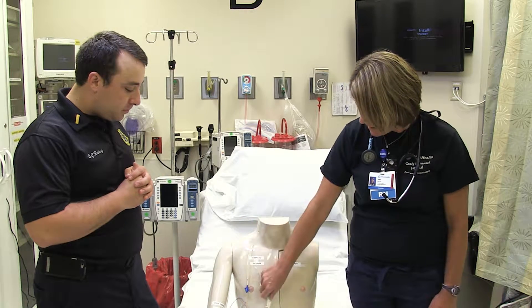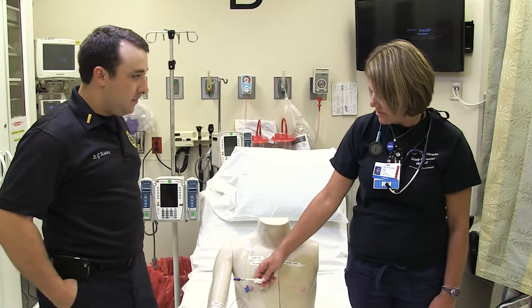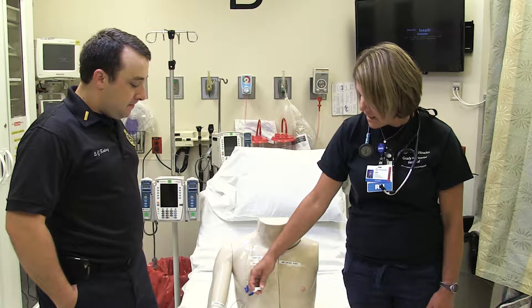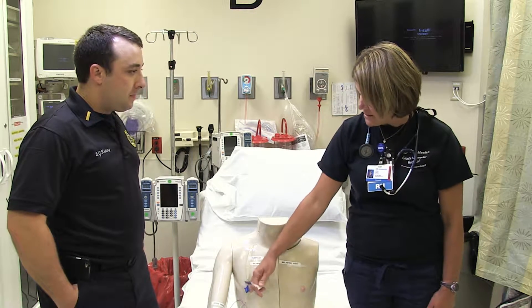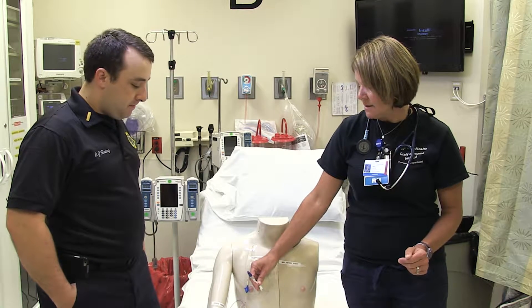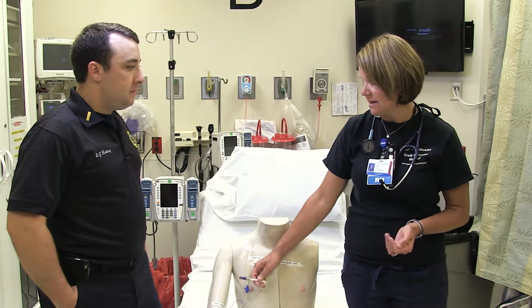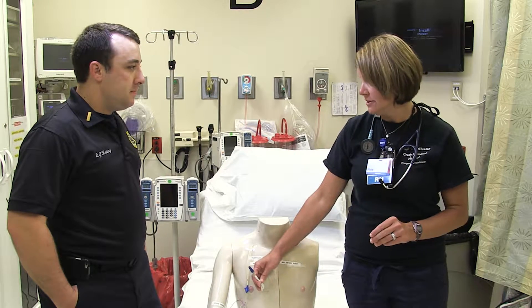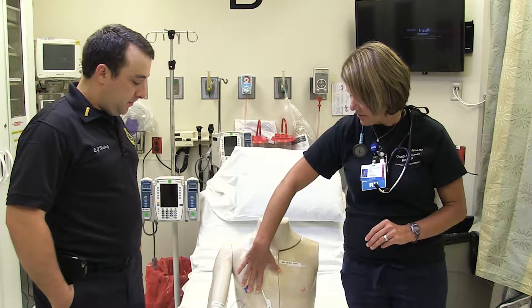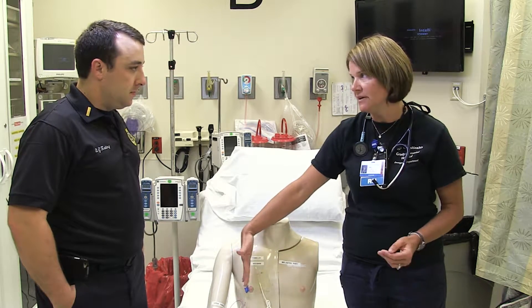This one is a Hickman. We don't see too many Hickmans, but what you might see is somebody that has a temporary dialysis catheter — you would see two of these. In an emergency, you can use these. The dialysis catheter will always be a dual catheter, and the family or patient are going to know that it's a dialysis catheter.